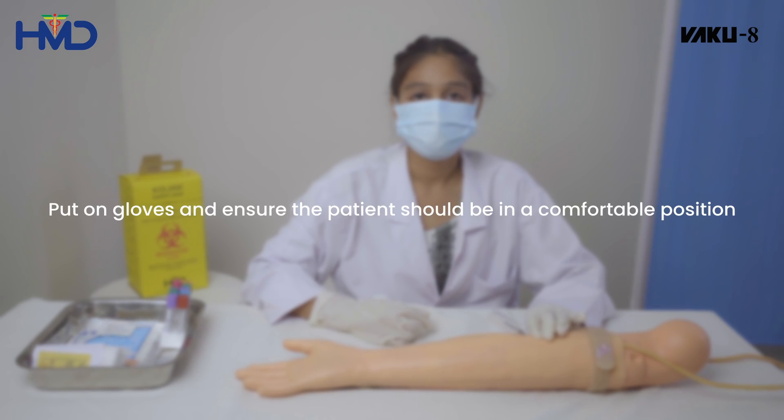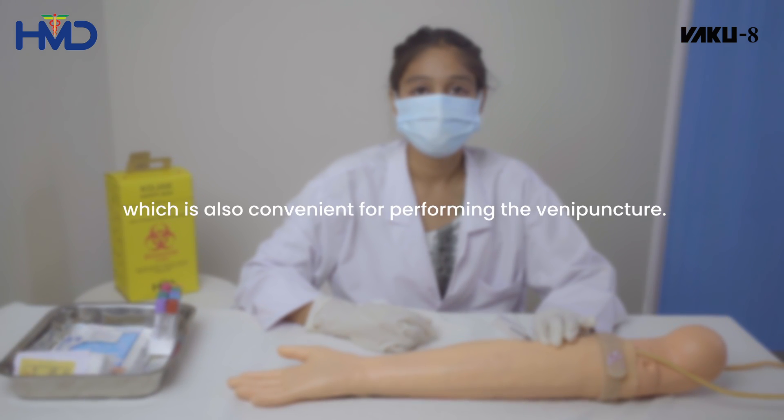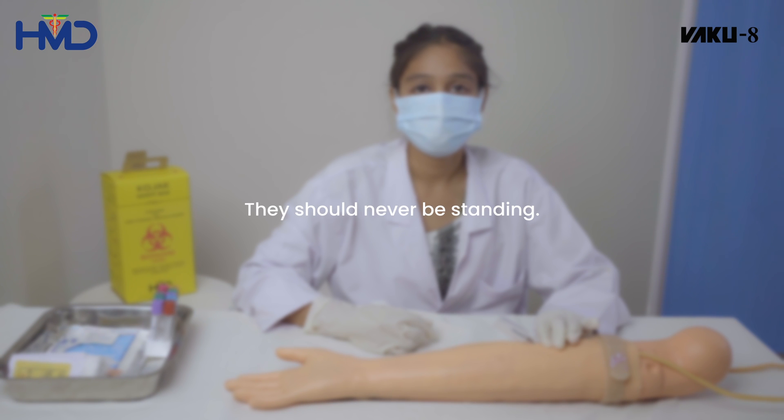Put on gloves and ensure that the patient is in a comfortable position, which is also convenient for performing the venipuncture. They should never be standing.